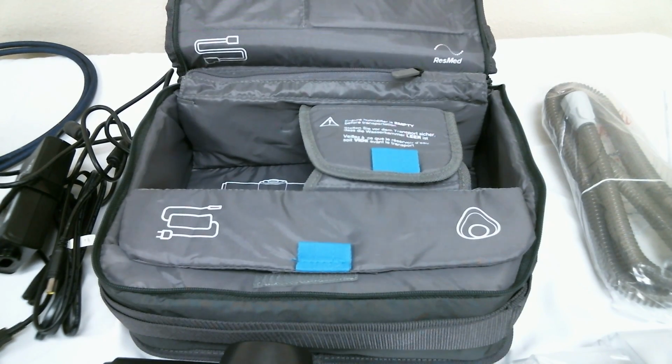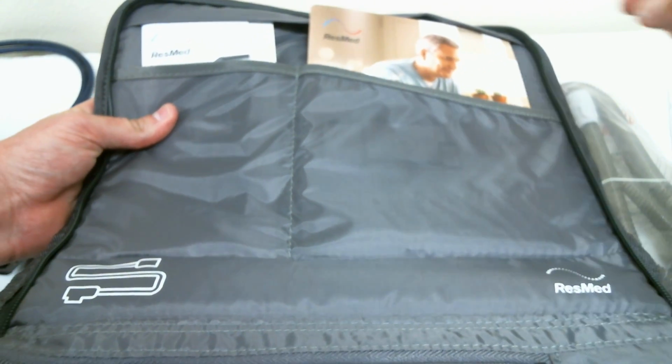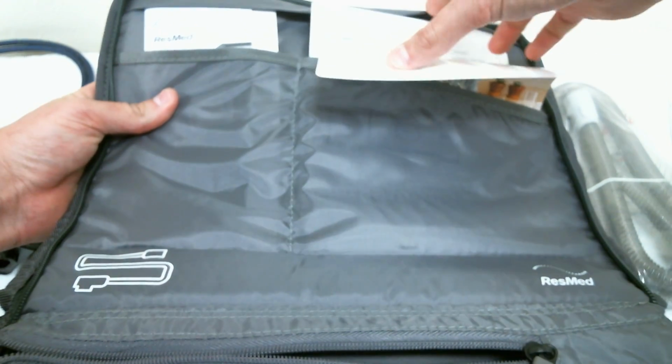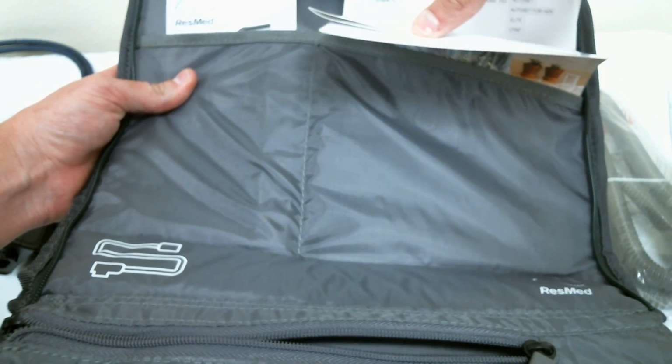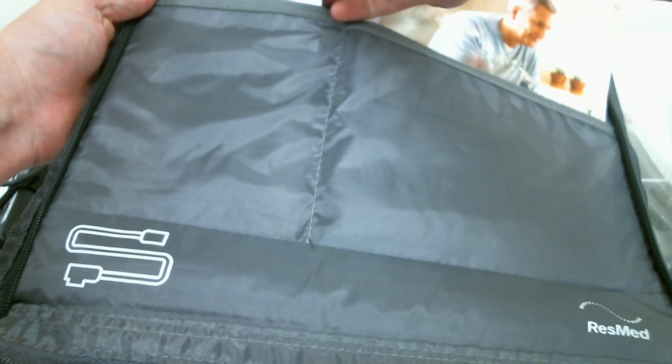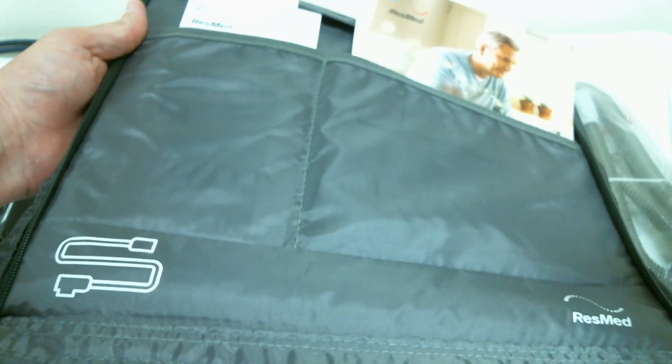Before we put your travel bag away, I want to point out your manufacturer information in the top pouch. Information on myAir, quick setup guide, and your user manuals on the right. On the left, you have your SD card envelope.